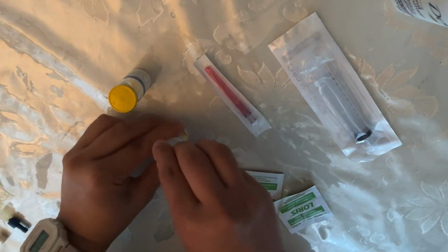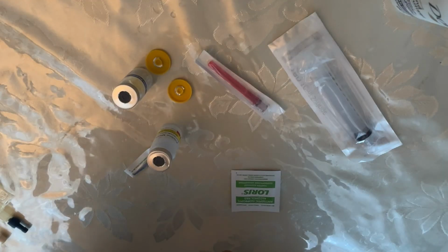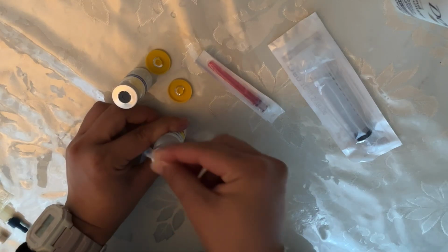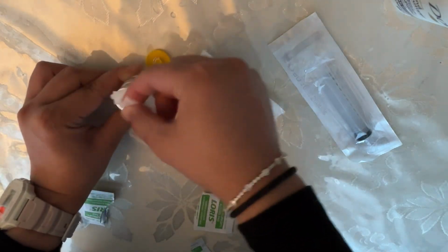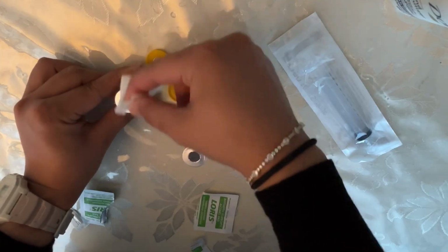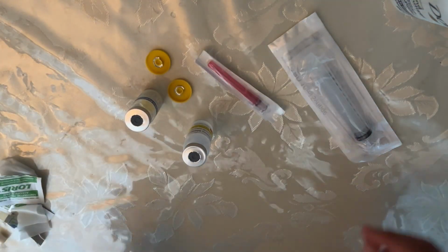Okay, I'm just going to open my vial. Swab it for 15 seconds. Let it dry for 15 seconds and swab the other for 15 seconds. Let it dry for 15 seconds.